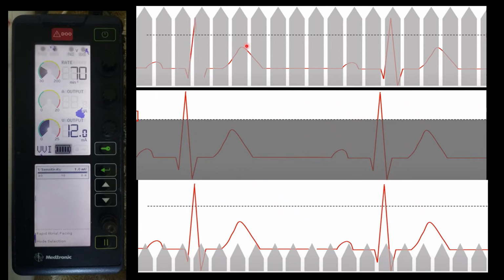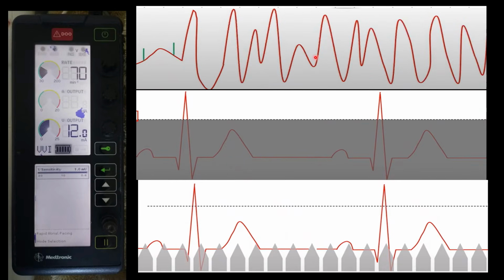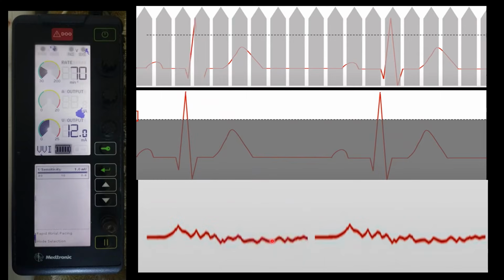The pacemaker cannot sense this R wave, so the pacemaker starts to pace regardless of the R wave, which can lead to overpacing from the pacemaker, so it can lead to ventricular fibrillation or VTach. In the lower example, the pacemaker has higher sensitivity and lower millivolt, so it can sense the T wave as heart activity, so it does not pace. So here the patient may go into asystole.